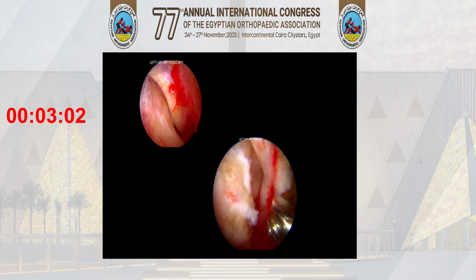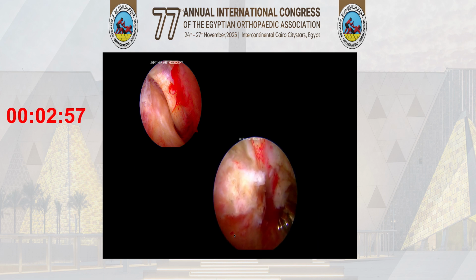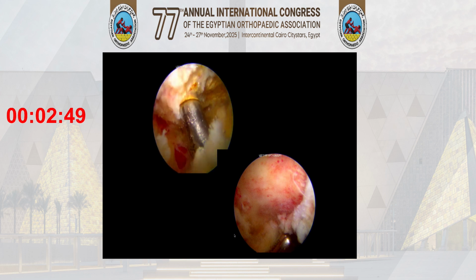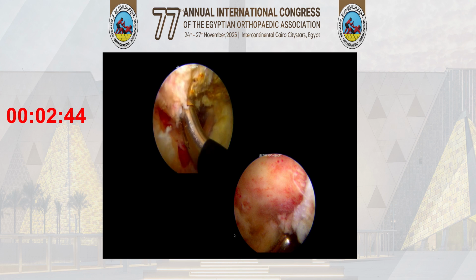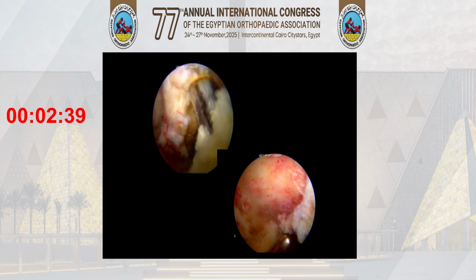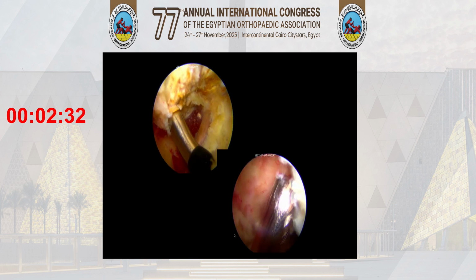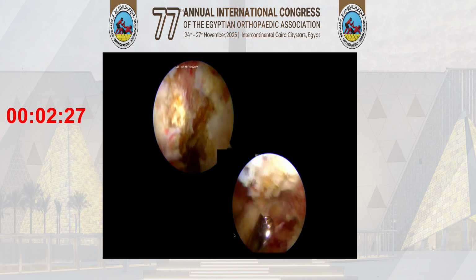This is the MRI. You can see that there is a bump which is hitting the labrum, and you can see how the labrum is actually enfolding on the head. So this is excessive acetabular work. This is the same way we try to preserve the labrum, but because you're resecting around 1.5 centimeters of bone, usually that will not allow you to preserve the labral tissue, and the remaining labral tissue is very friable. So this is, again, resecting. This is the labrum, and on the right side, the acetabulum.